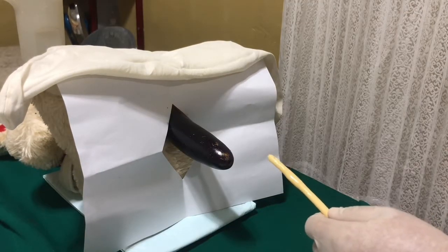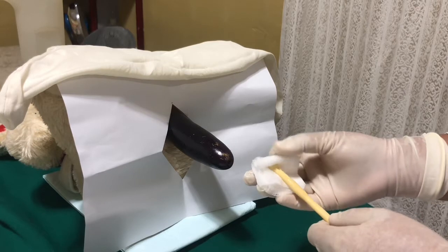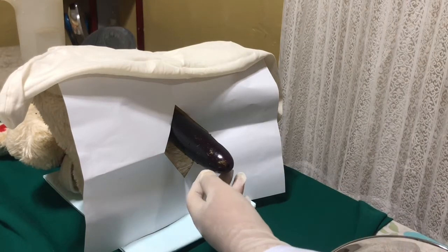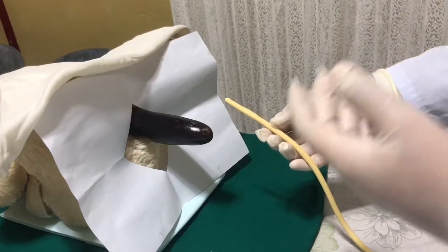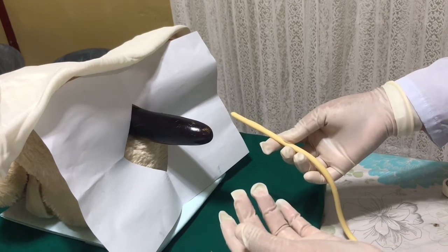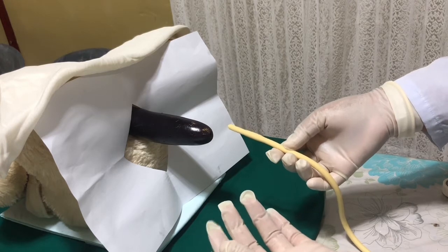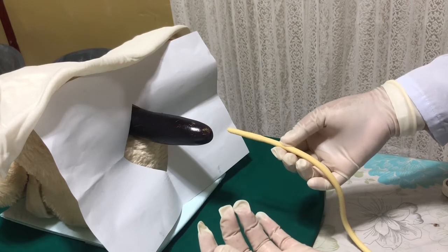Lubricate 6 to 8 inches of the catheter tip. Hold the penis perpendicular to the body and pull up gently. Hold the catheter in the dominant hand. Steadily insert the catheter about 8 inches until urine is noted in the drainage bag or tubing. Do not force the catheter through the urethra. Ask the client to breathe deeply, and rotate the catheter gently if slight resistance is met.